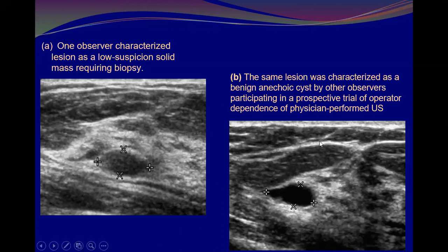The fat is medium gray in the pre- and retromammary region, and even the fat within the glands looks almost the same. Here there is contrast between the echogenic fibroglandular tissue and the fat. And look at the skin, it is sharper here than there. That means this image is optimized.